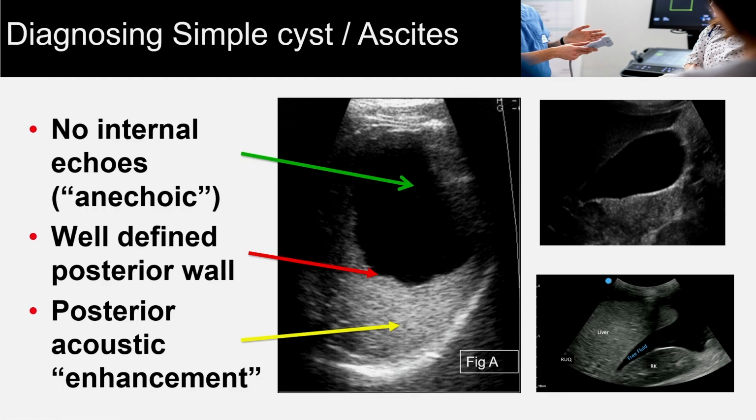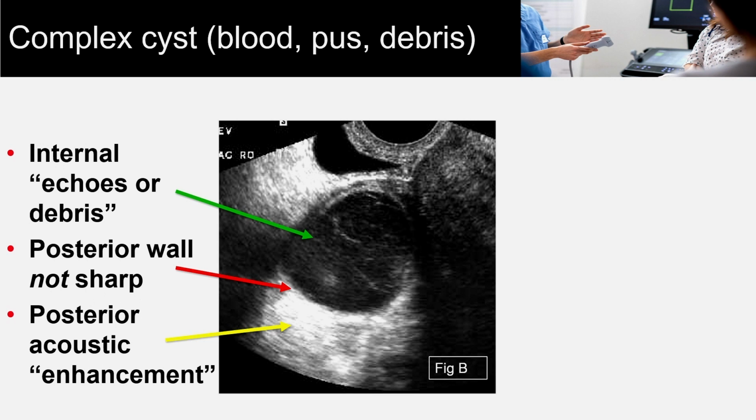Again, simple cystic structures. When we look at that complex cystic, the complex part either comes from blood, pus, debris, or sometimes even tumor can do this. So this is a complex cystic mass that has gone through hemorrhagic transformation. You can see internal echoes, some retractile clot with a little bit of septa forming within it, some clumped up nodular sort of clots forming in it.